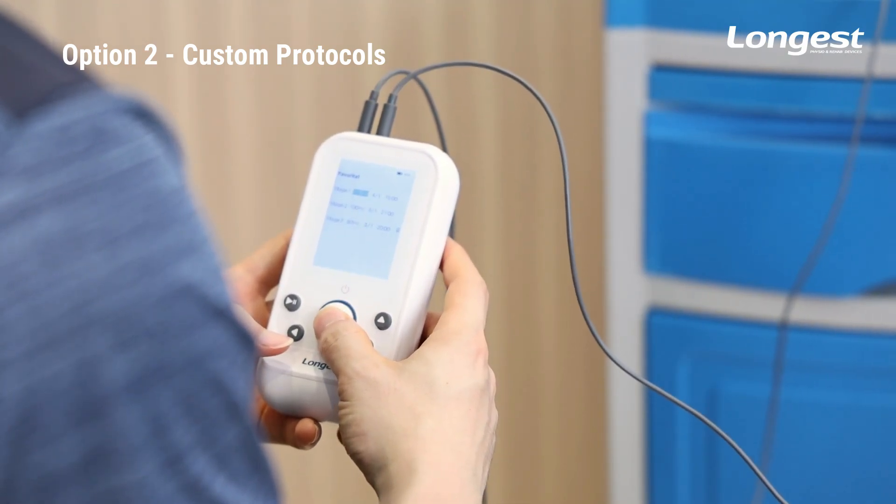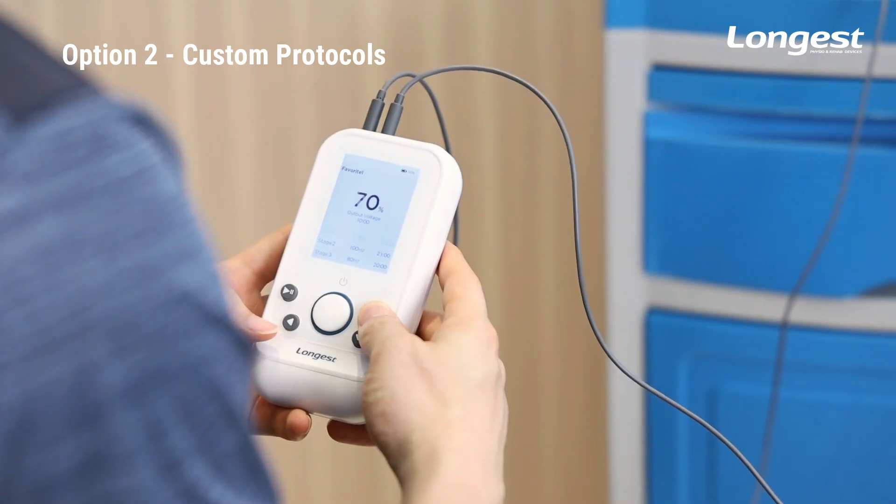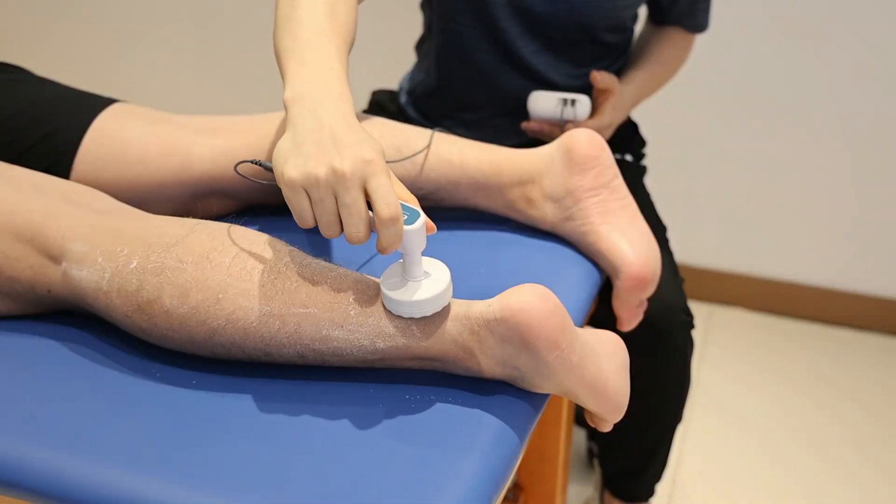After finishing the adjustment, press the button to enter the treatment interface. Then you can adjust the output voltage, and press the button again to begin the treatment.